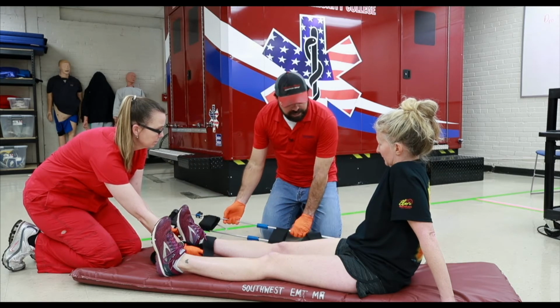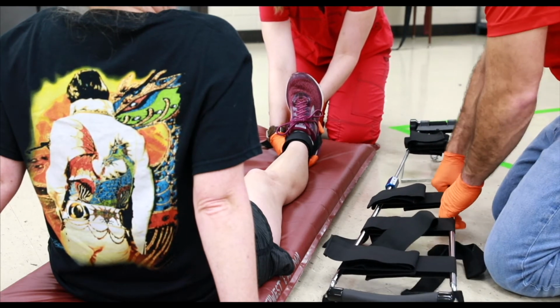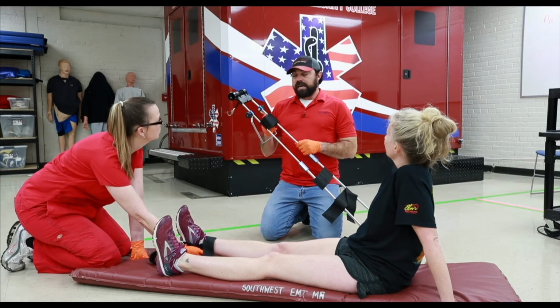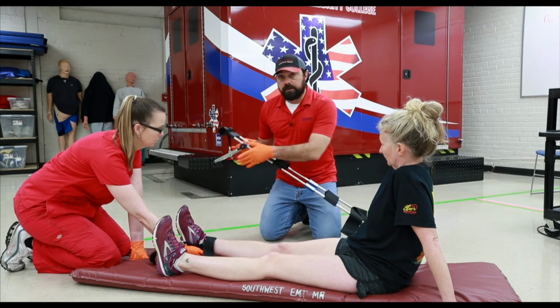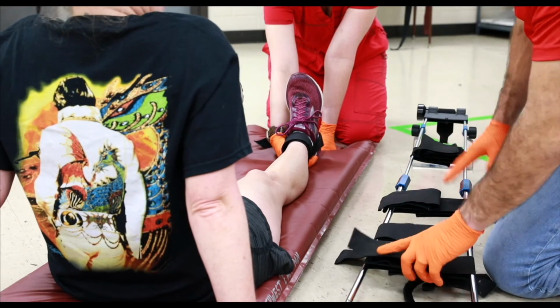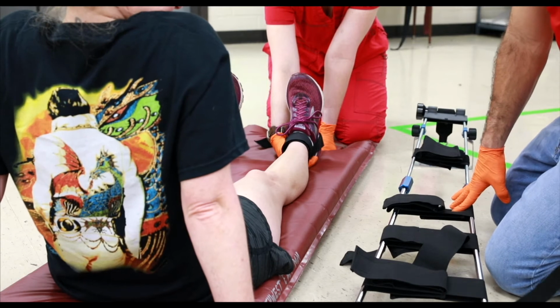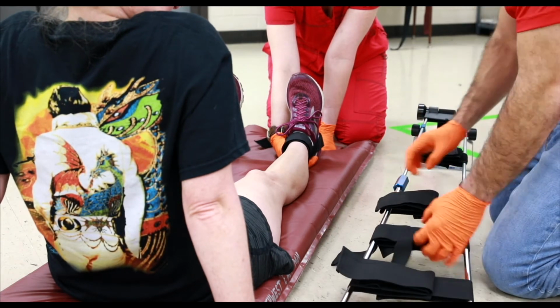So on the uninjured leg side, I'm going to give myself enough distance so that once I connect it, I can crank a little bit of traction. Doesn't have to be a lot. Like I said, we're just looking to get relief. Remember, the kickstand goes to the bottom. Seems like that would be a given. Not always. All right, so the kickstand goes to the bottom. You have your straps, including your ischial strap. You kind of have this lined up. You want to make sure you turn these little center knobs back so that it's tight.